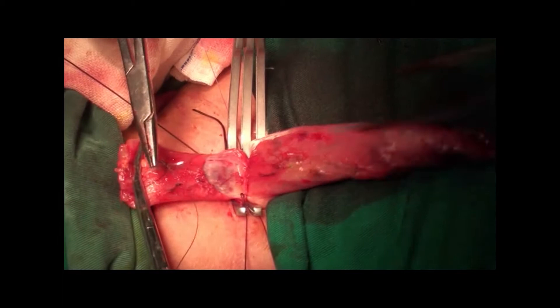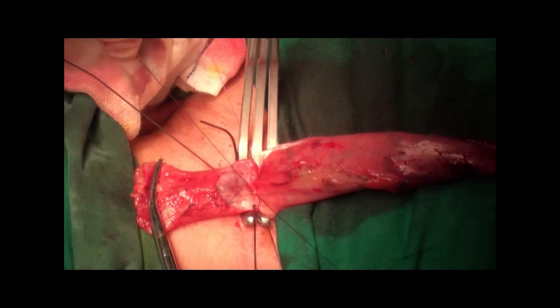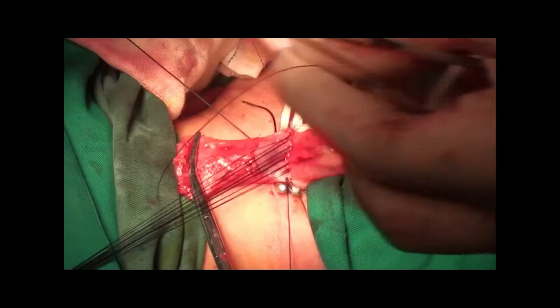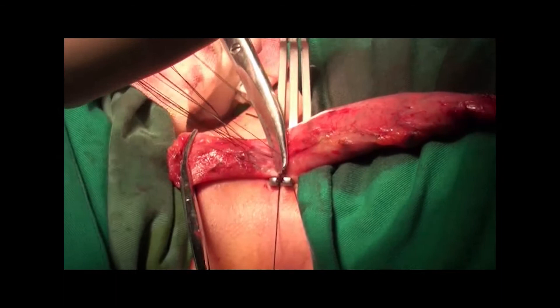A mosquito forceps was used to hang the suture and define the corner. The two layers were sewn with 7 to 8 stitches of interrupted sutures. The last suture was also hung by mosquito forceps.